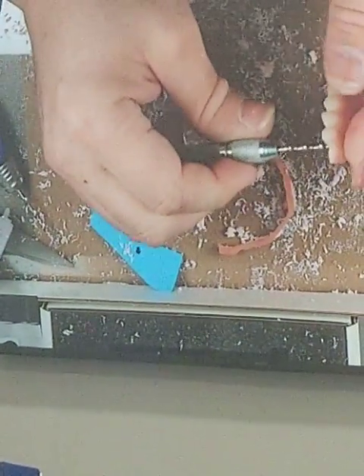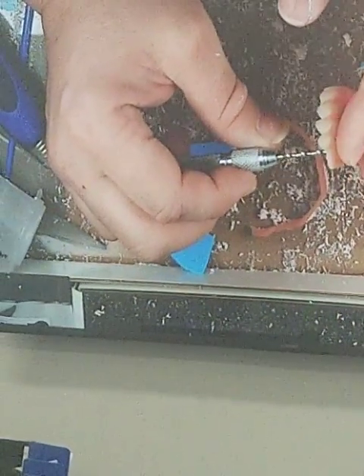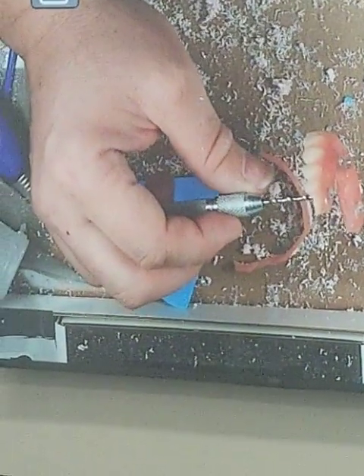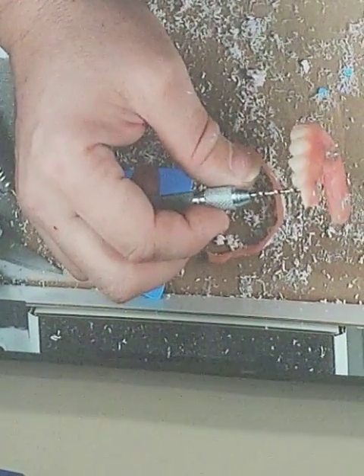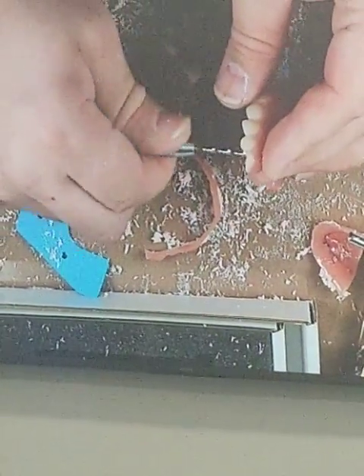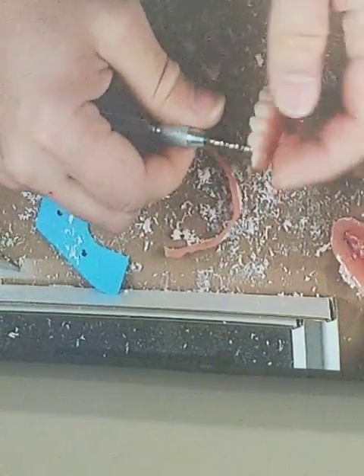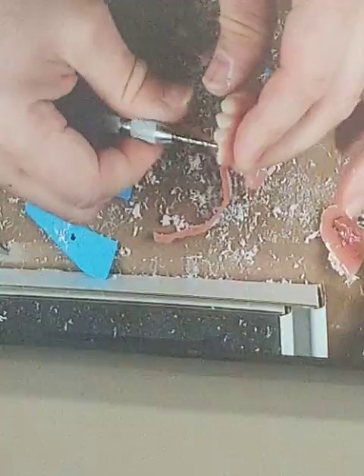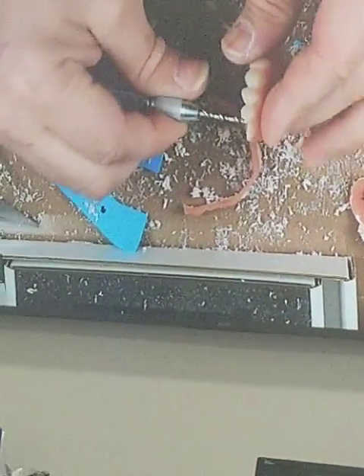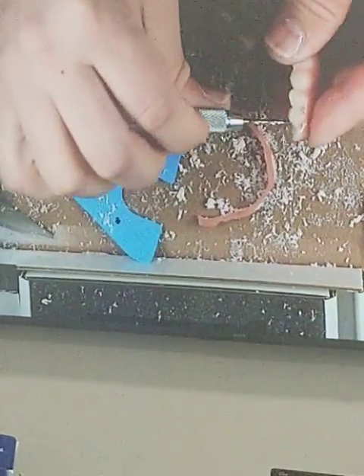And then I'm going to go down here. The important thing to know: all I'm doing is trying to create the path for the head of that septal fastener to come out. It might come out on the drill — if that happens, cool; if it doesn't, no big deal, there are other ways to get it out. I'm going to start just turning that drill without any pressure, then slowly add more pressure. I'm countering the pressure with my pointer finger because I don't want to punch that tie base out. I'm countering the pressure, just creating a pathway there.